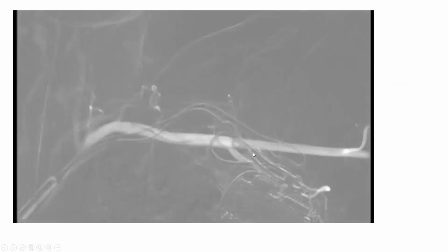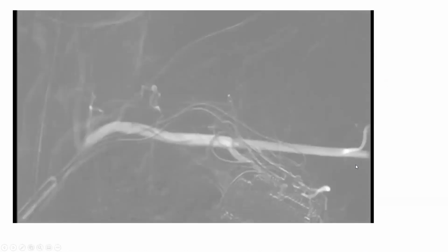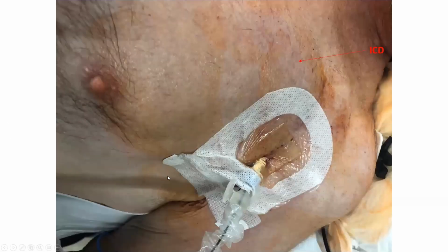This is another illustration showing you the lateral thoracic artery in a difficult case. You can always tell, even in a case with an ICD, the origin of the lateral thoracic artery, especially if you go cranially. And when you position the balloon pump at the end of the case, you secure the outside of the balloon pump catheter to the chest wall. You secure it to the chest wall, not to the arm.